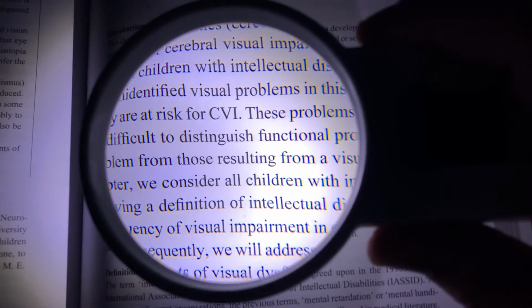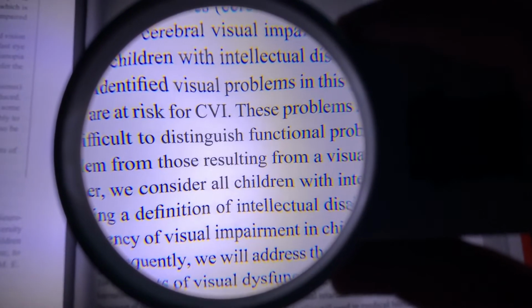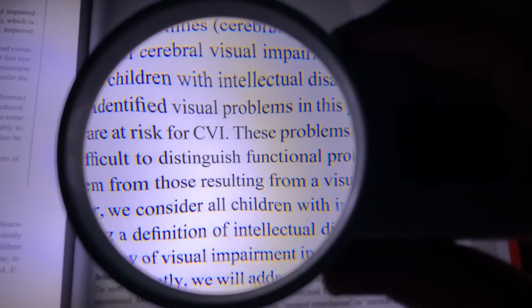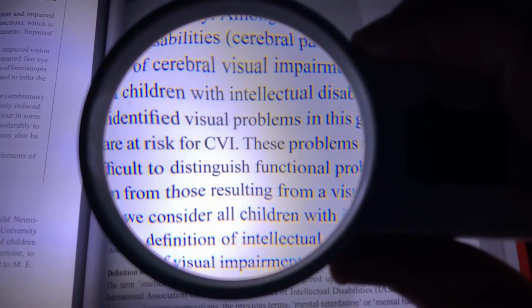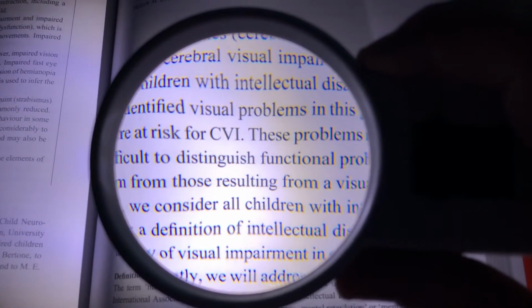Now compare the 4X Optelec hand magnifier. Again, it's not a fixed focal distance that a stand magnifier provides, so you do have to kind of play going back and forth a little bit to get it to where you need it. The brightness is a bright white light, and it's a good flood of the area with the light.